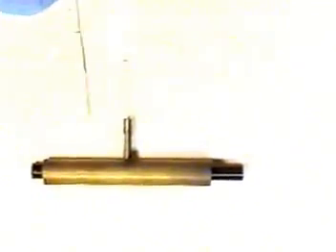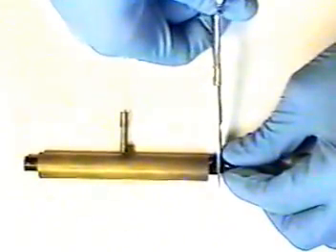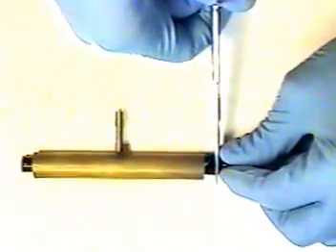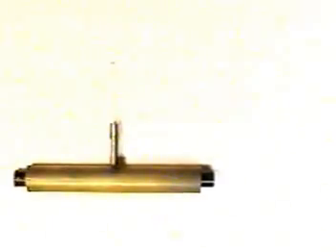We will need to cut the bending rubber sheath to be able to apply it over this vacuum jig. Cut and leave approximately 5 millimeters of bending rubber sheath on each end of the vacuum jig. On one end, pull the bending rubber sheath over the vacuum tube.